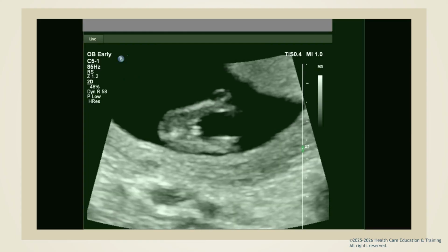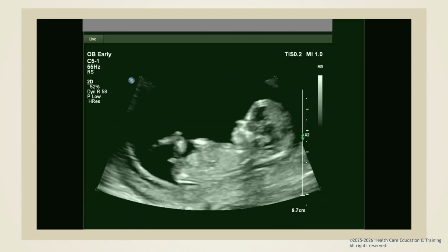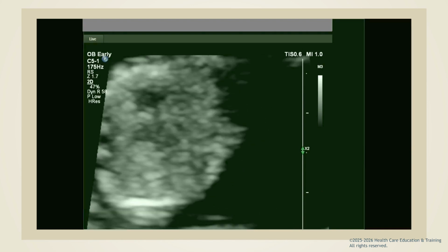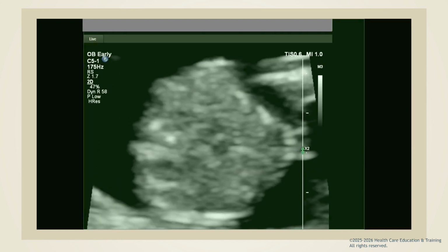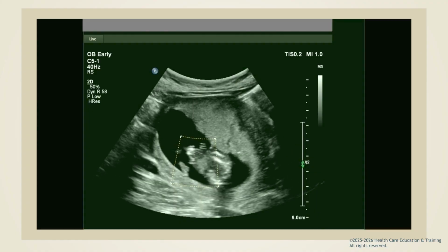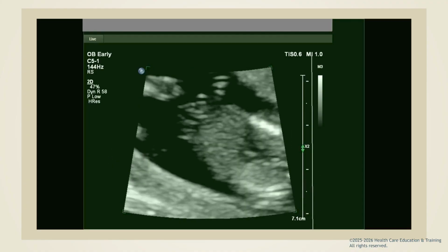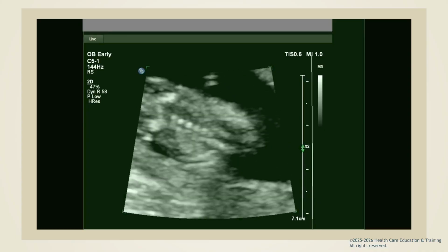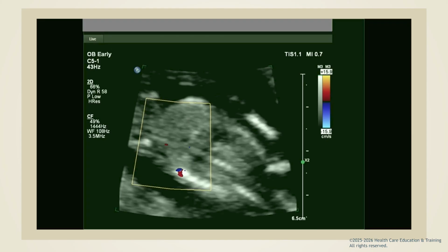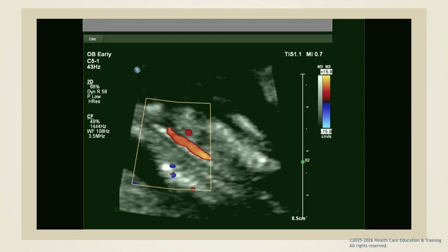It might be easier to see if a penis or vulva are forming, but it is still difficult to confirm on ultrasound. The heart, while not fully formed or functioning, is beating, and a flickering motion can usually be seen where the heart is located. With special equipment, some of the early shapes of internal organs, like the stomach or bladder, may be seen, depending on the quality of the image. The umbilical cord, which is the connecting structure between the placenta and the fetus, provides nutrients.